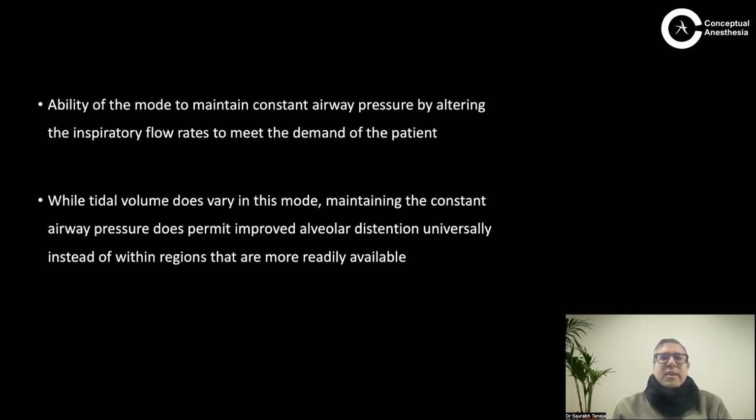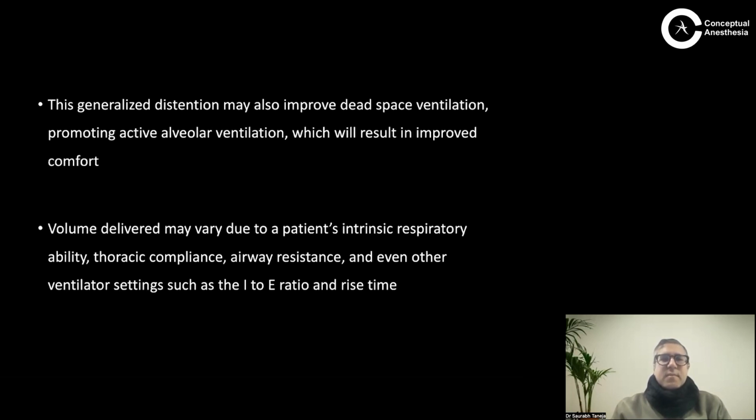Another benefit is the ability of the mode to maintain constant airway pressure by altering the inspiratory flow rates to meet the demand of the patient. So you maintain a constant airway pressure, and if the patient has increased demand, he will have increased inspiratory flow. While tidal volume does vary in this mode, maintaining a constant airway pressure does permit improved alveolar distension universally, instead of only within regions that are more readily available. So again, diseased alveoli are ventilated in a better way. And this improves dead space ventilation, comfort, and VQ mismatch.